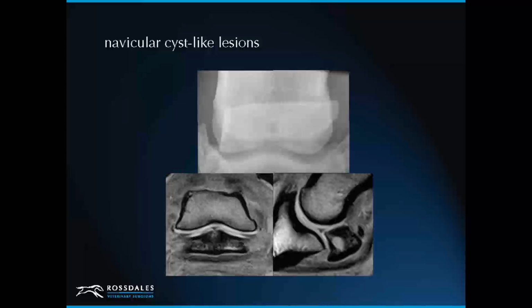X-raying that, you might say, oh dear, we need to put this horse down. It's got an erosive lesion on its navicular bone, and these can actually respond quite well to coffin joint medication. So it gives you that little bit of extra information.